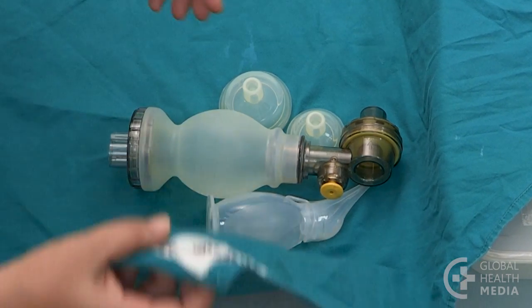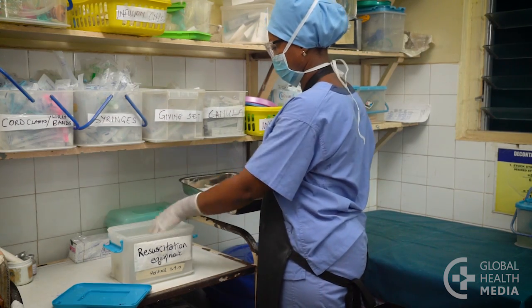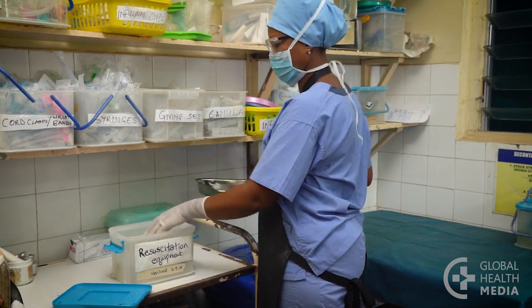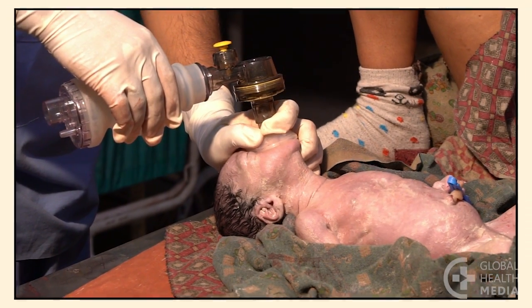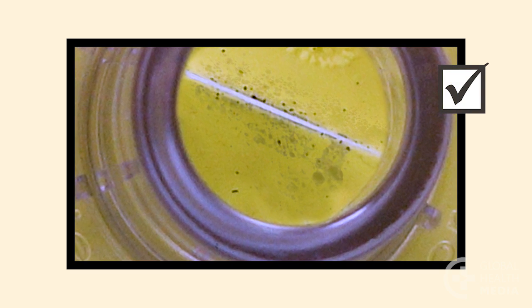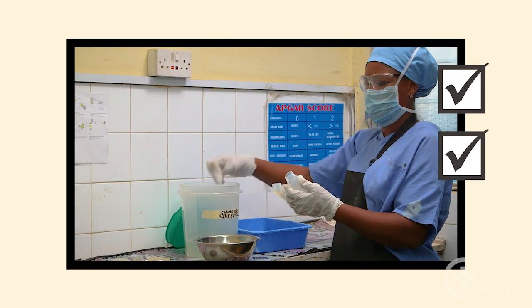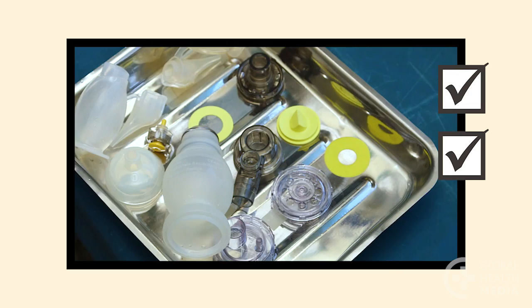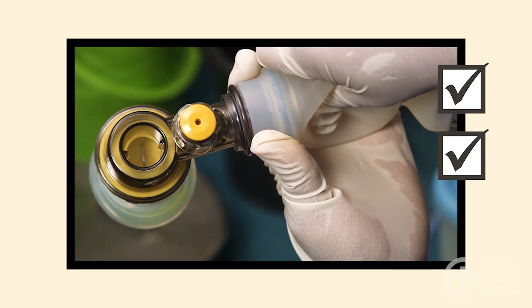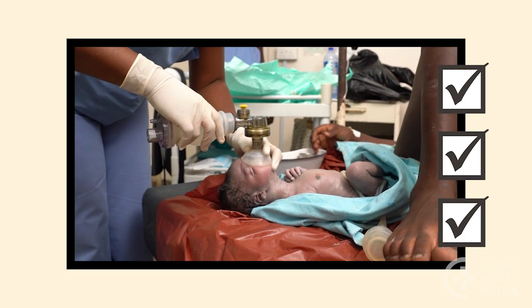To store the equipment, either wrap it in sterile linen or place it in a plastic or metal container that has been disinfected. The lid should fit tightly. Remember, to prevent the spread of dangerous germs, thoroughly clean your resuscitation equipment. Follow the steps: wipe the equipment, take it apart, clean then disinfect it, dry then put it back together, test, and store it. Make sure your equipment is safe for the next baby.